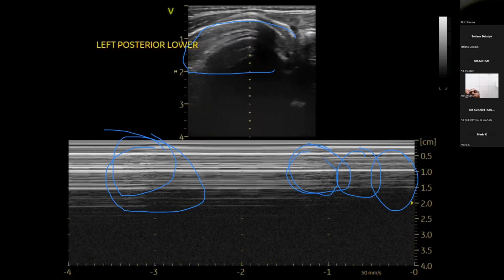I think if you were able to turn off harmonics and if you're able to reduce your frequency just to get depth, then what you will be able to see is a better pleural slide. And that pleural slide will then represent better, because the seashore sign presents with an acute demarcation between pleural sliding and the distal area over here, which technically is not sliding. That's why you get this appearance. And over here, I think it's because you can only see the superficial areas with your harmonics on that you're getting an artifact. For me, absolutely no doubt.